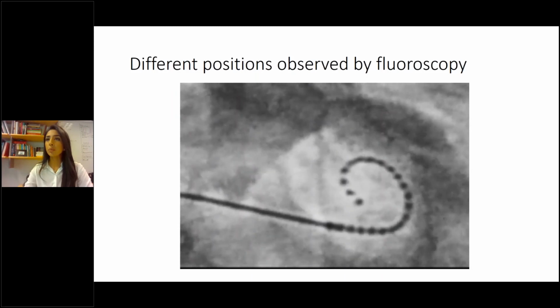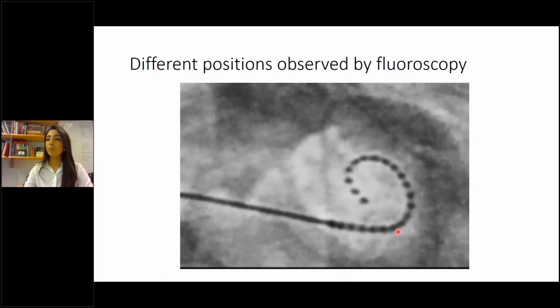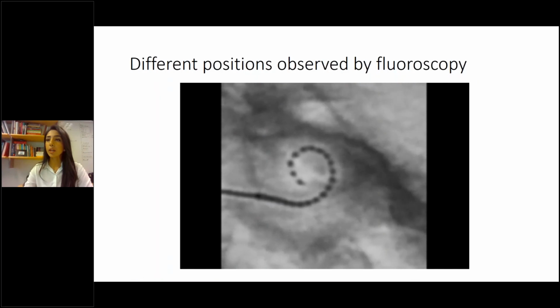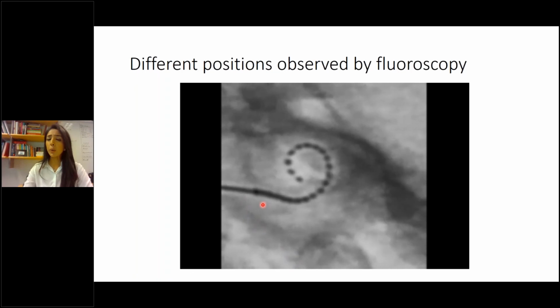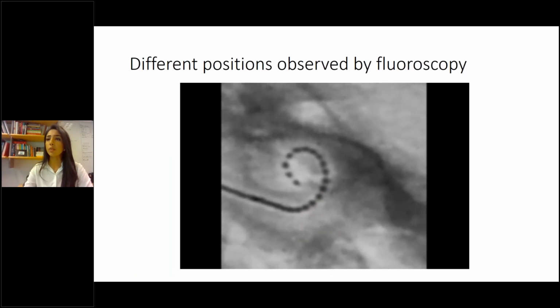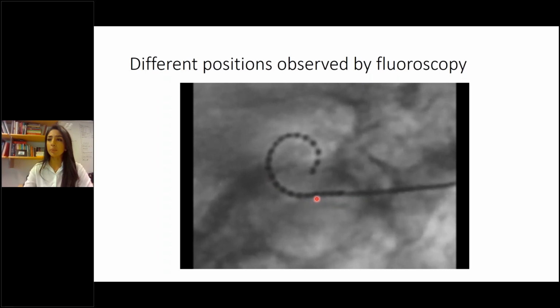Here we can observe different positions of the electrode during fluoroscopy. Here we can see movement to the lateral wall while trying to insert deeply, and then a pullback maneuver where it comes more proximal to the modiolus. In this second patient, we were trying to insert the electrode deeper, but here we can observe very soon a bulging effect of the electrode in the basal turn of the cochlea, and then quite a lot of movement in the basal turn. And in this third patient, we can see a bit deeper insertion at the tip, but also the bulging effect in the basal turn especially.